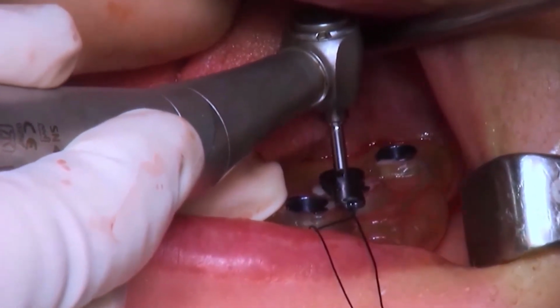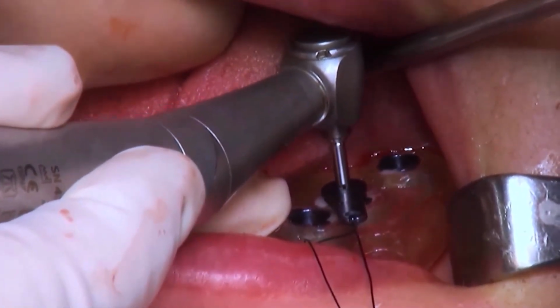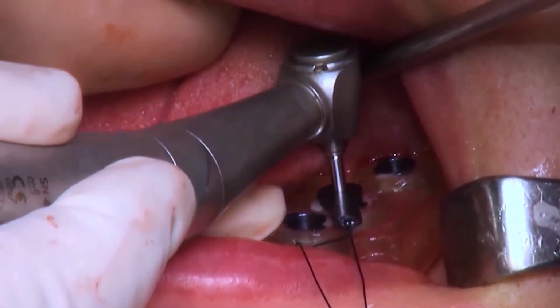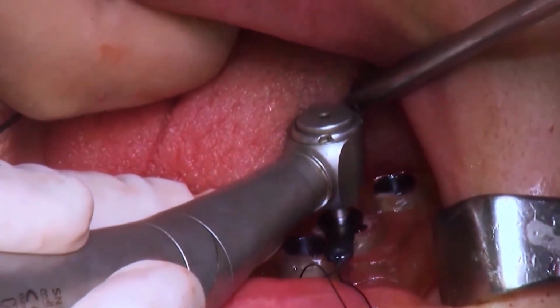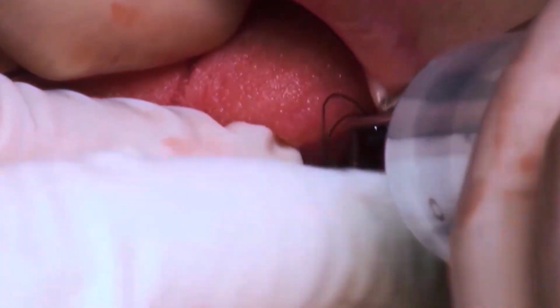The first drill is the most important one to drill, because if there is an error in the first one, there would be errors in the rest of them. Therefore, you should be careful to drill the first drill precisely.